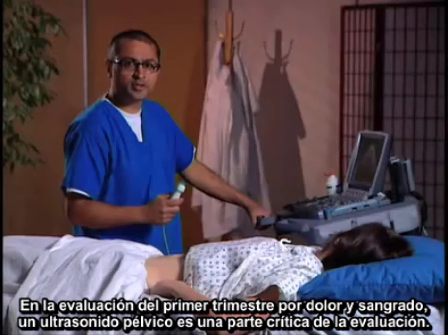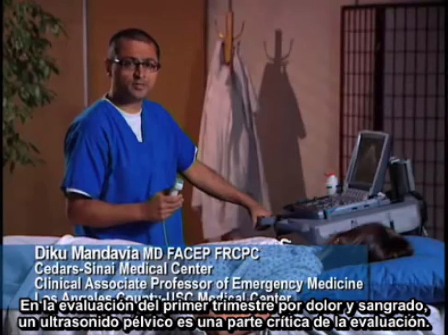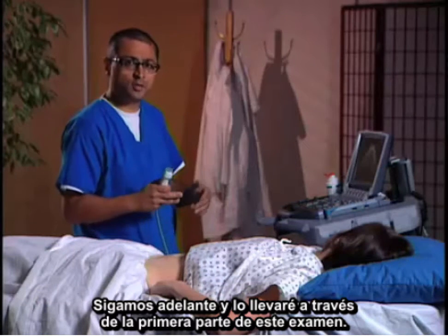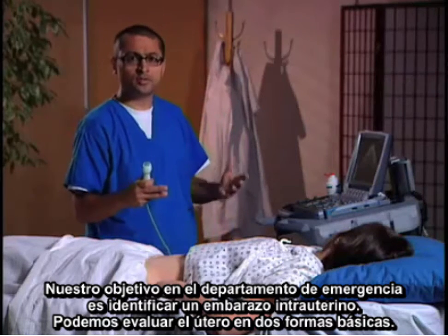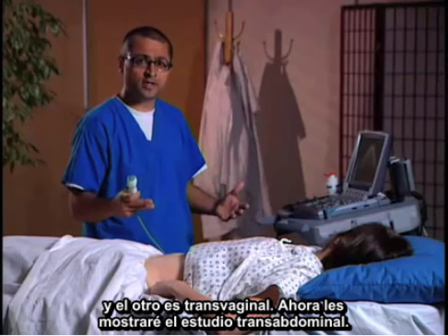In evaluating first trimester pain and bleeding, a pelvic ultrasound is a critical part of the evaluation. We're going to go ahead and take you through the first part of this examination. Our goal in the emergency department is to identify an intrauterine pregnancy. We can evaluate the uterus in two basic ways. One is a transabdominal approach and the other is a transvaginal approach.